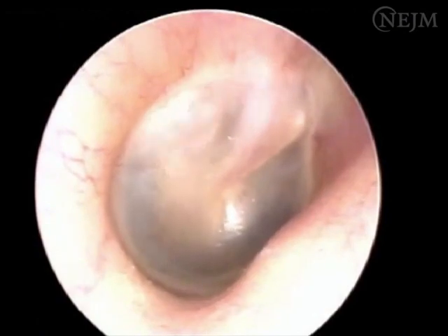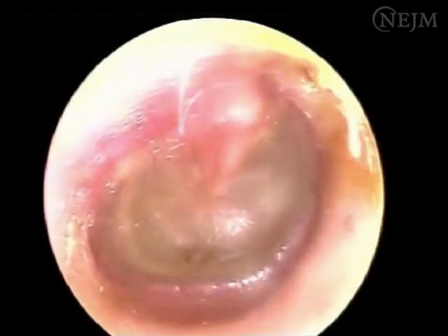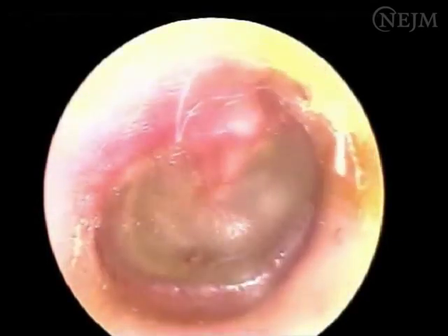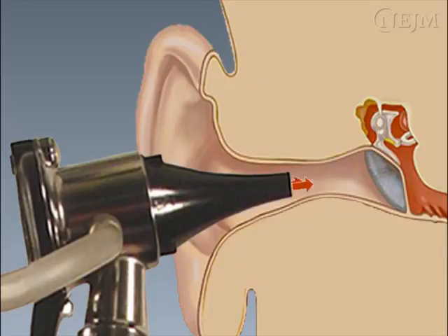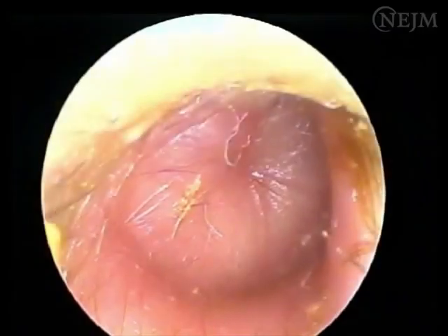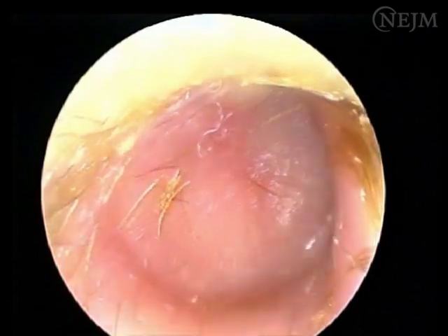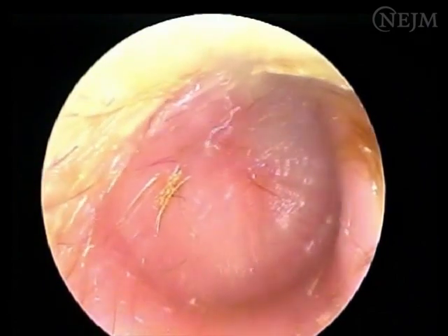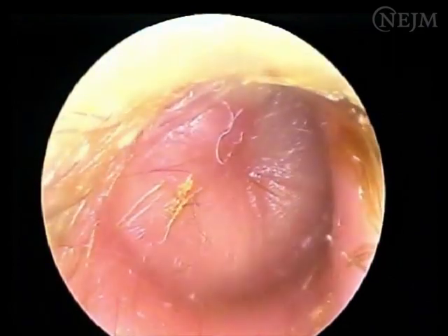In the absence of middle ear effusion, the tympanic membrane will move briskly. When middle ear effusion is present, as in acute otitis media or otitis media with effusion, mobility will be decreased or absent. A common mistake is to use a speculum that is too small relative to the size of the ear canal, which causes a leak in the system. Proper performance of pneumatic otoscopy is critical for the accurate diagnosis of acute otitis media and otitis media with effusion. Clinicians should master this technique in order to provide optimal care for children with this common condition.